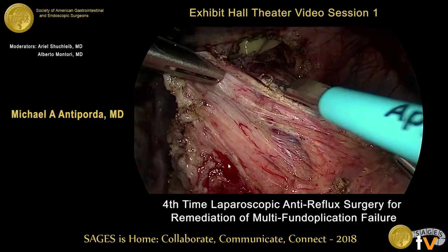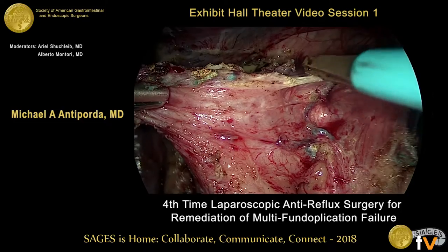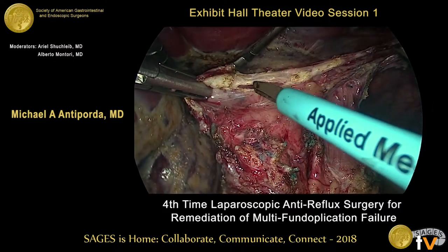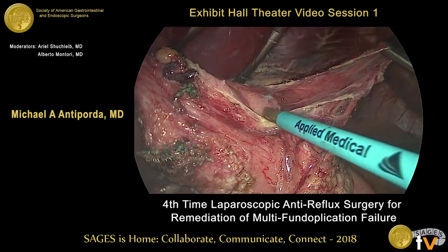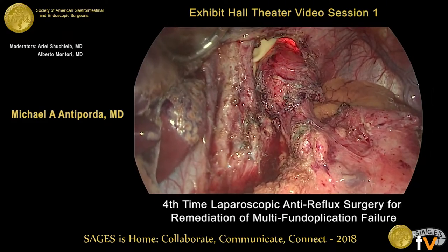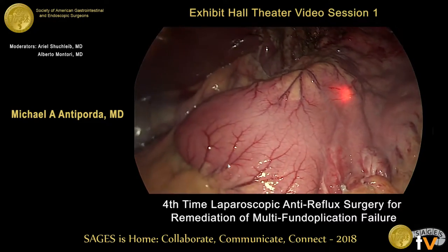Once the mediastinal dissection was complete, we turned our attention to taking down the prior fundoplication. This is done with a combination of cold scissors as well as low-voltage monopolar cautery. Throughout this operation, we minimize blunt dissection to minimize any blood loss or possible injury to the stomach or esophagus. Once the wrap is taken down completely, we are able to establish normal anatomy. We tuck the fundus back up into the left upper quadrant. We perform flexible upper endoscopy to confirm the level of the GE junction and also to ensure we hadn't caused any injury to the esophagus or stomach with our dissection.